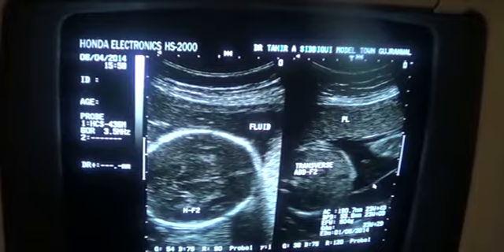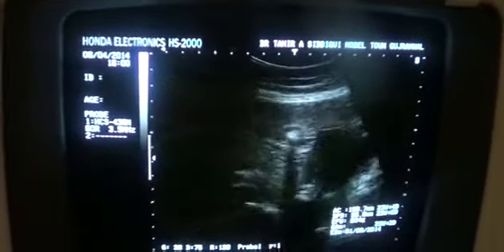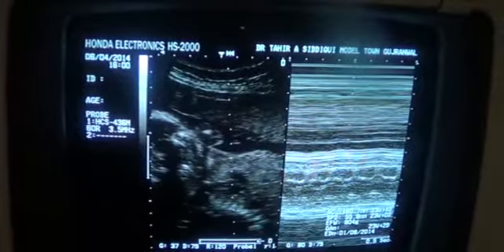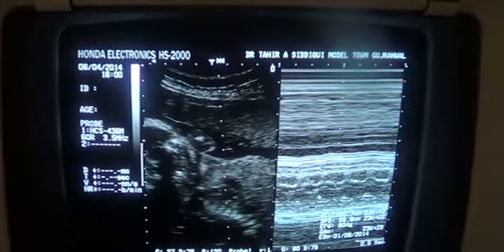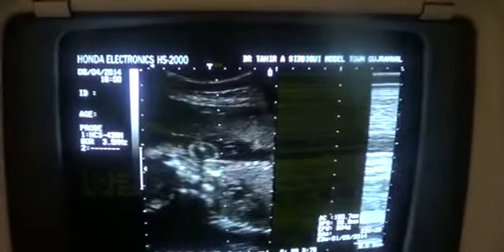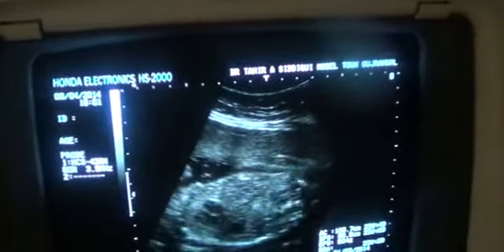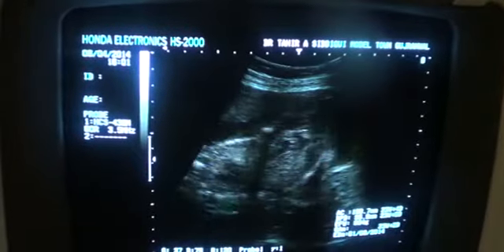So no focal defect is seen relating to the anterior wall. This is the vertebra, this is the umbilical vein. So this fetus is normal. This is fetus number 2. This is the heartbeat. The heartbeat of this fetus is again 150 beats per minute with regular waveform. This white, bright, echogenic line is the femur. No pathology seen relating to fetus number 2.